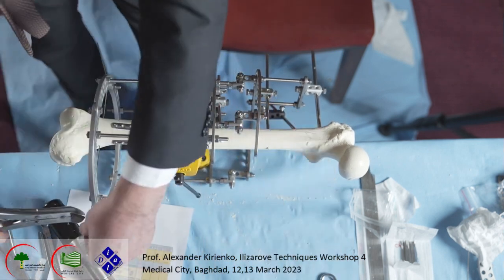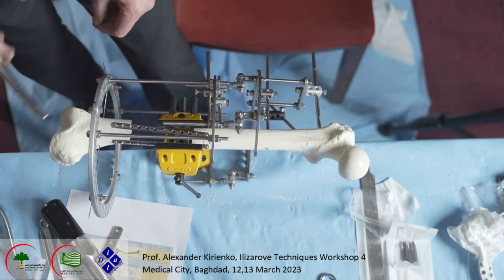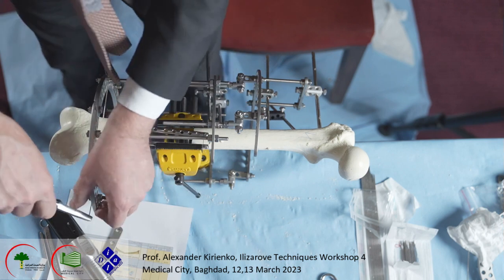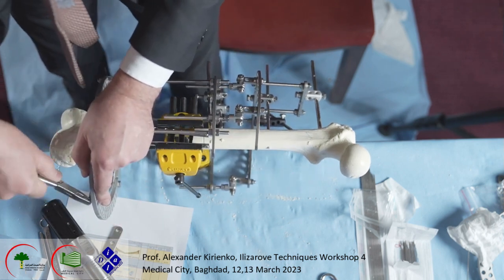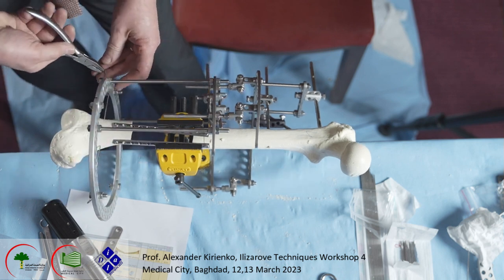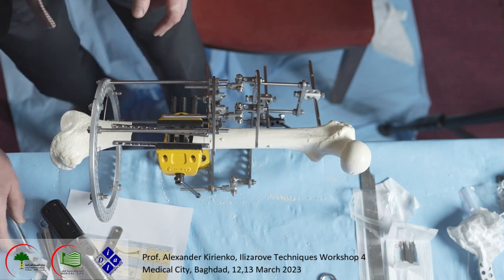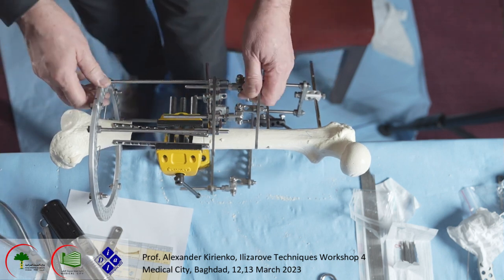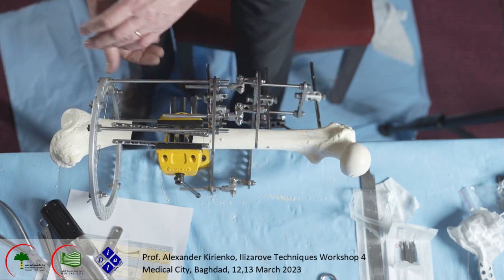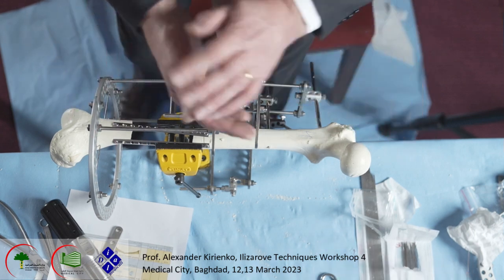Okay. Here we do the classic way, cut, bend. Okay, and after that we should improve stability with the half pin.